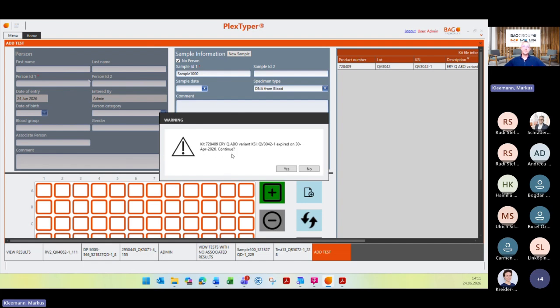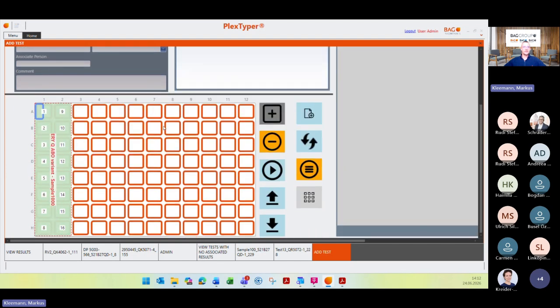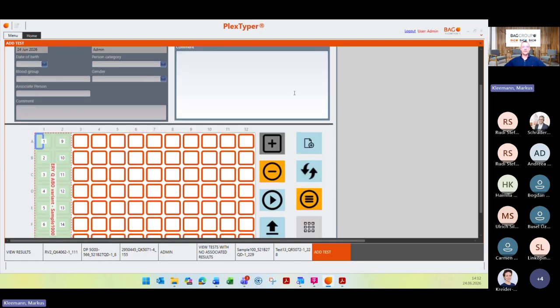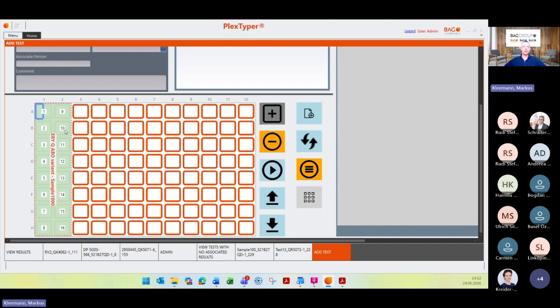And that means that the kit file here, for example, expired at the end of April this year. And you have two options. You can click no, then you can choose another kit file, or what I will do is click yes. If you want to analyze all data, you can also do this with this expired kit file, but you will also see this warning that the kit file is expired on the report.